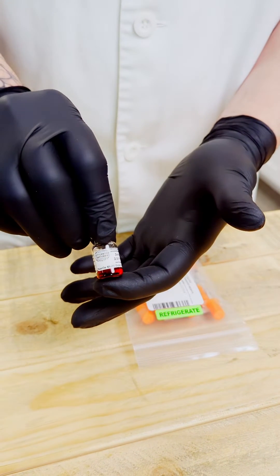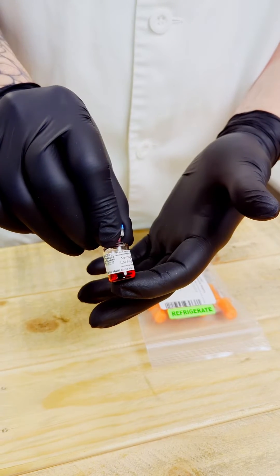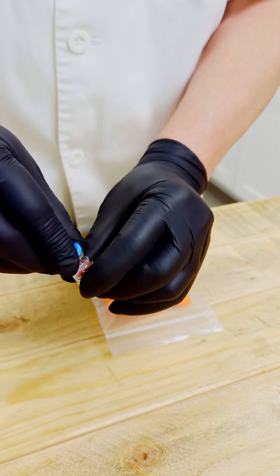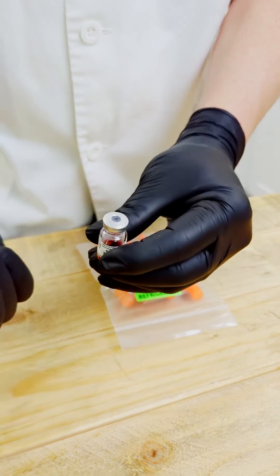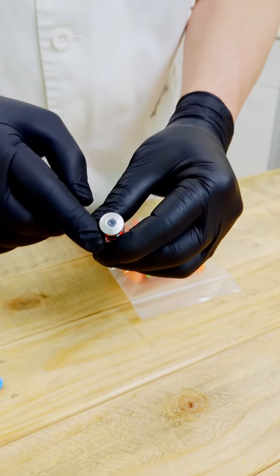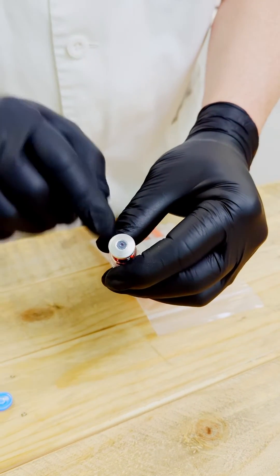So, this is the vial that we will give to you. We'll have different concentrations, just a sample one. When you first get it, you'll have a cap on it and you want to take that blue cap off, just like that. And that exposes this top part here, which is where we put the needle through.